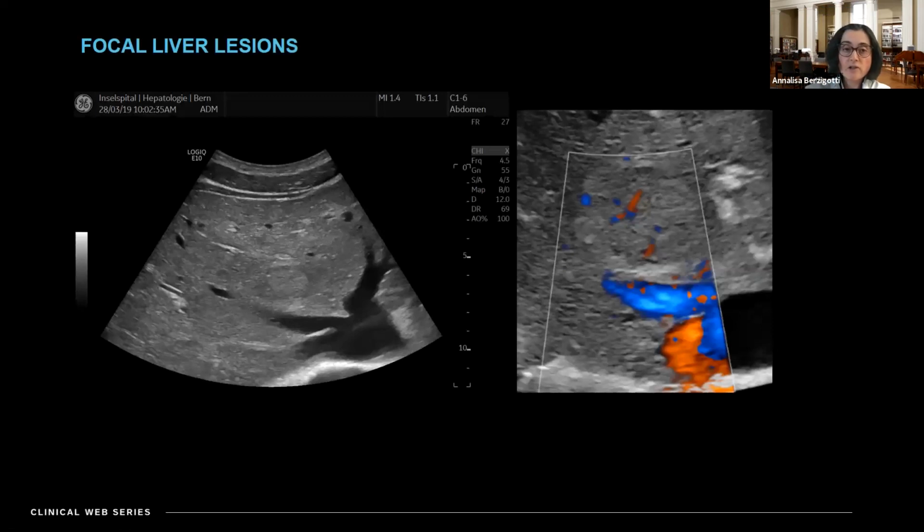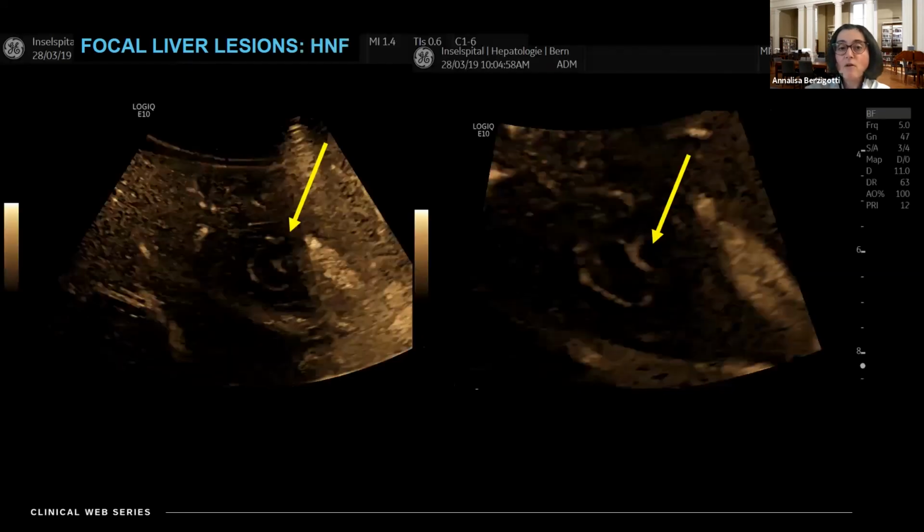This is a patient that we could observe with this hyperechogenic lesion, which has an aspect that already on power Doppler suggests very likely a focal nodular hyperplasia, because you see a central vessel, and on spectral Doppler, it seems to have an arterial flow. But I think with this additional technology, you can be pretty sure. So you see that there is a central artery, and in the other images, we could see that it was really the typical aspect you expect in FNH.